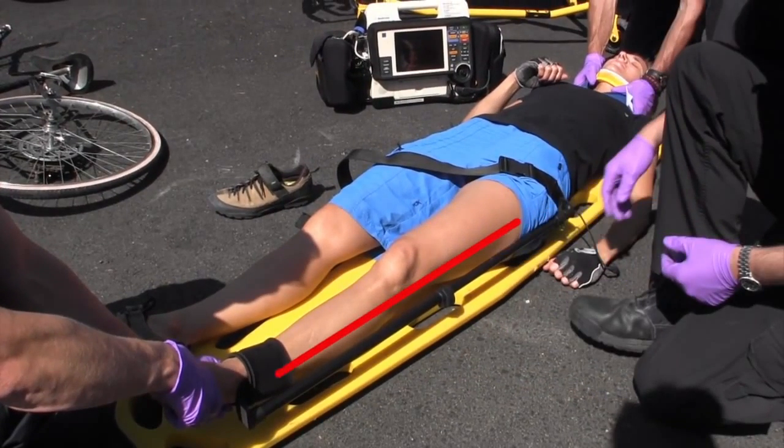Notice that the pole does not extend past the patient's foot. This is a tremendous advantage during evacuation and transport, especially in helos, extrication baskets, or other confined spaces.